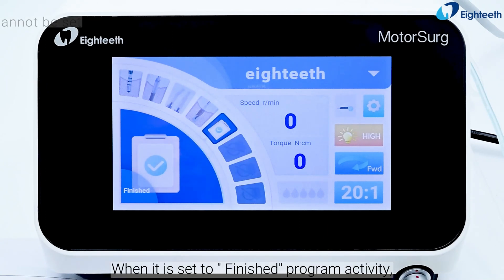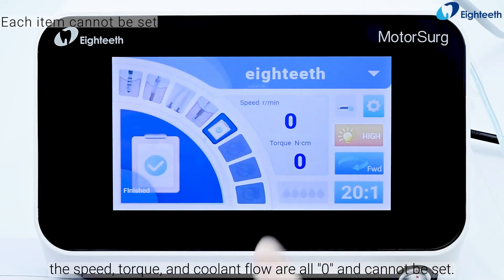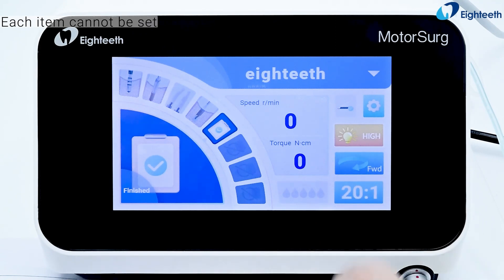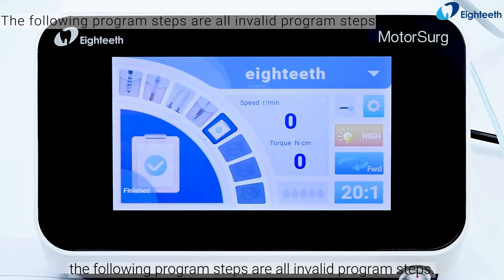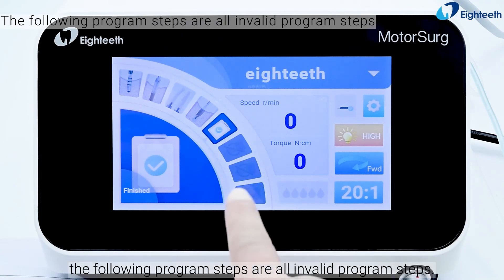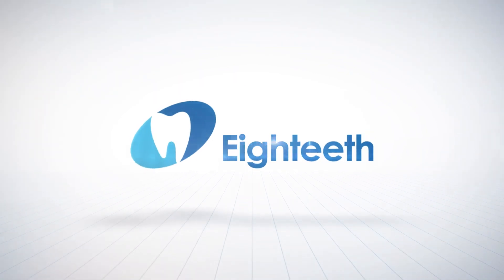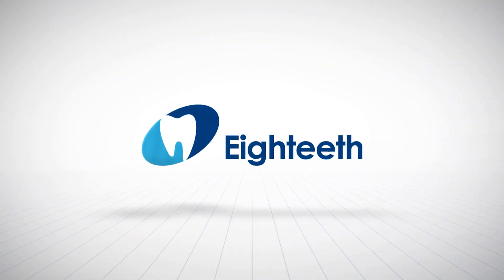When set to the finished program activity, the speed, torque, and coolant flow are all 0 and cannot be set. At the same time, all following program steps become invalid.